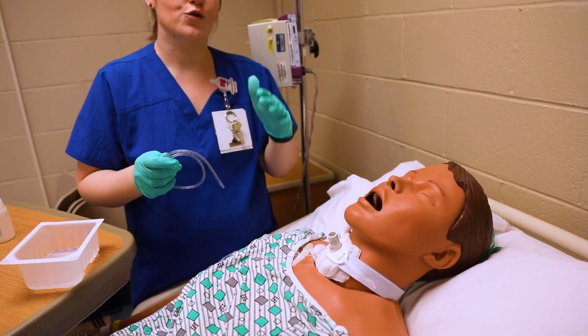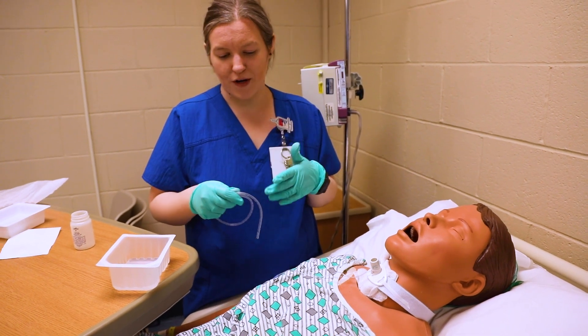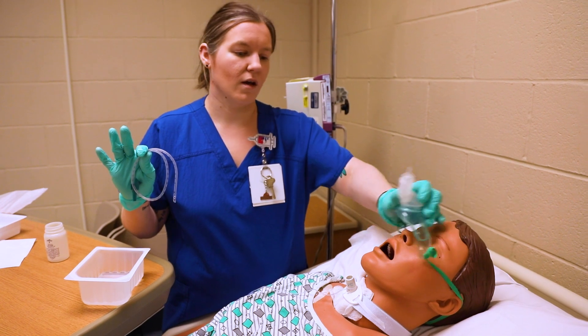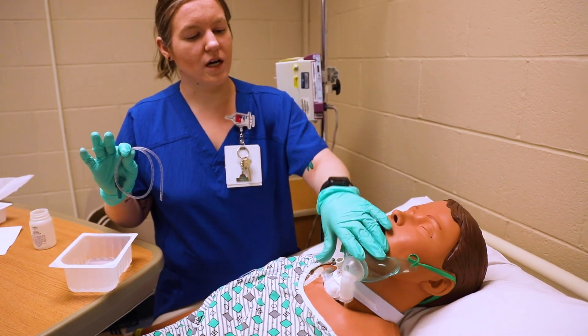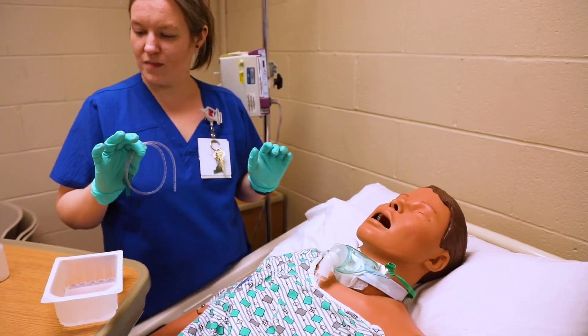You can suck it up again if you need to. I would only do a few passes — your patient is going to be coughing, and you may have to put the oxygen back on them. Use a new kit for every time you suction. Once we're done, go ahead and put the oxygen back on.